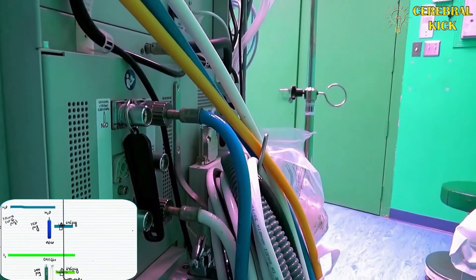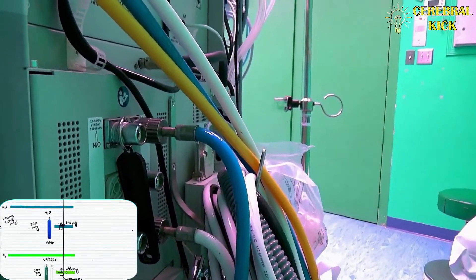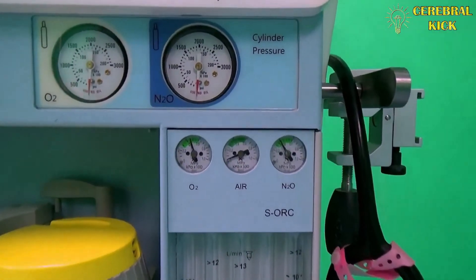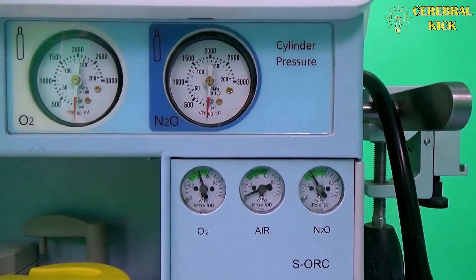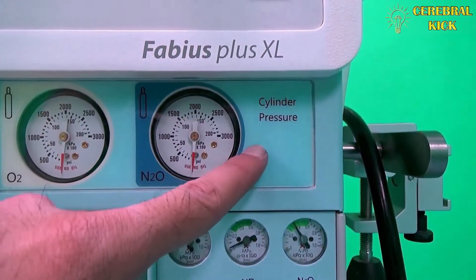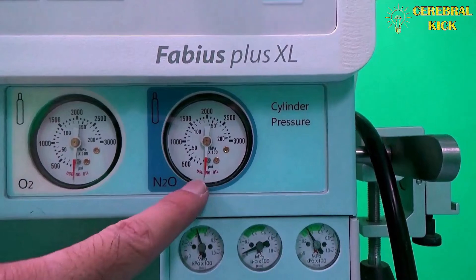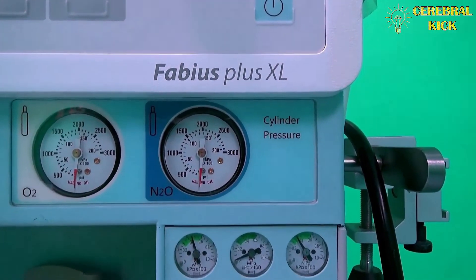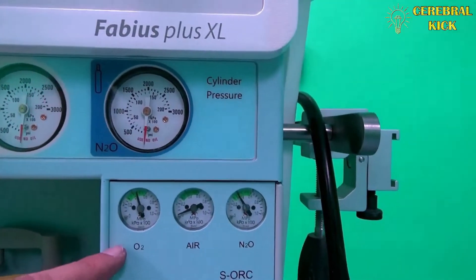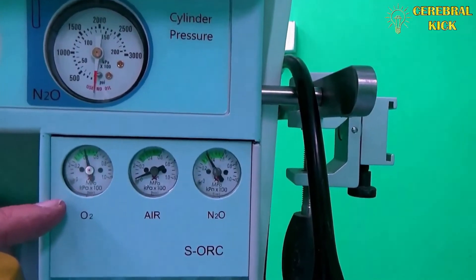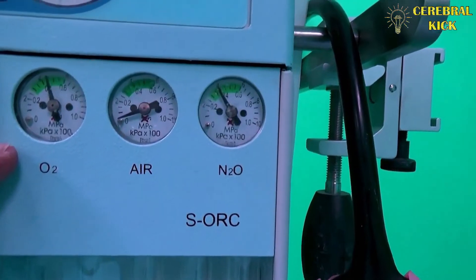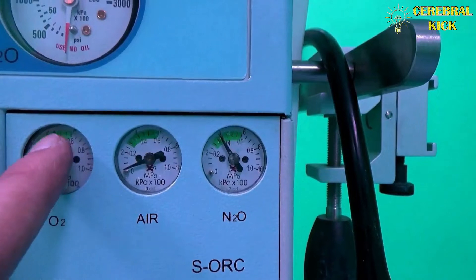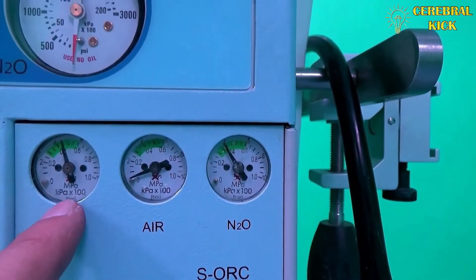A question arises: how can we know the exact pressures of pipeline and oxygen cylinders? Well, on the front panel, there's a separate pressure gauge for cylinders - you can see for nitrous oxide and oxygen it's zero at the moment because we have shut the cylinders. Below you can see the pressure gauges of various pipelines - for oxygen it's around 4.2 or 4.1 bar, so that accounts for around 55 to 58 PSIG which is quite normal.